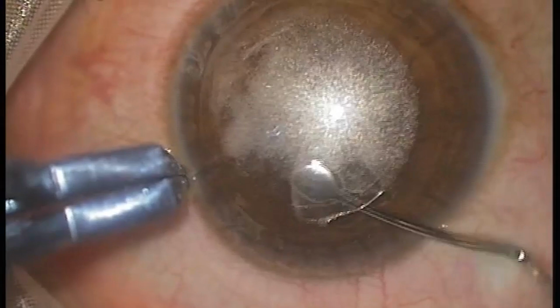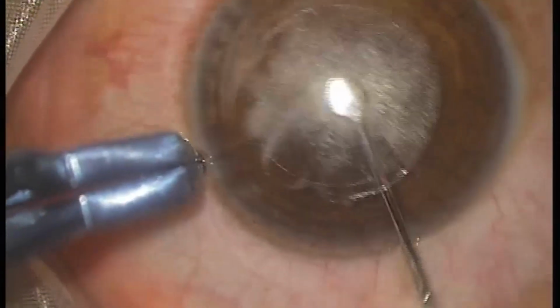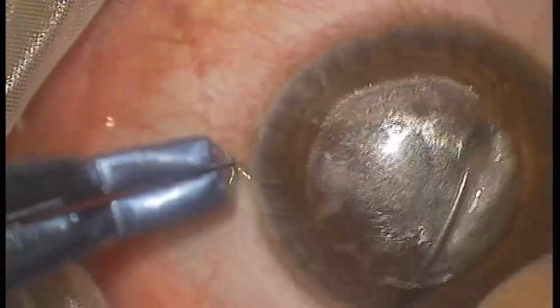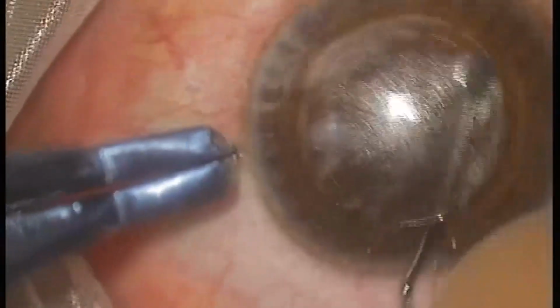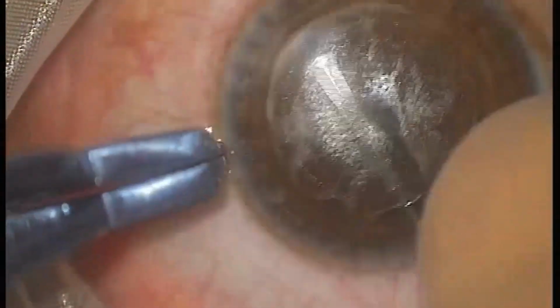undissected halves. With the appreciation of this sign, we were sure that the blunt dissector had entered the anterior lenticular plane first. The anterior plane was dissected. Thereafter, the posterior plane was dissected through the posterior channel.